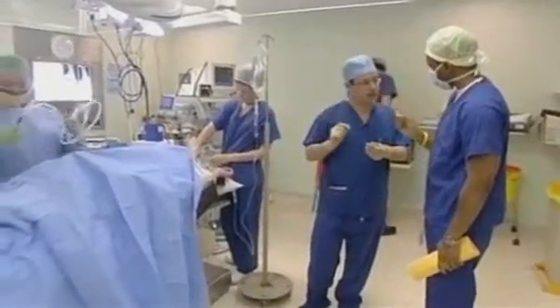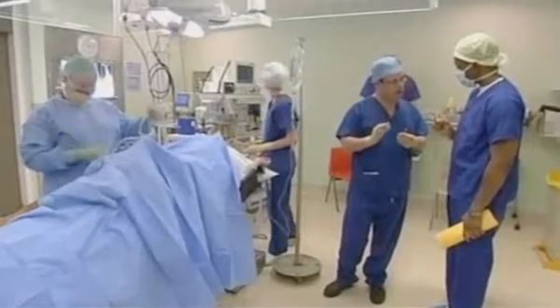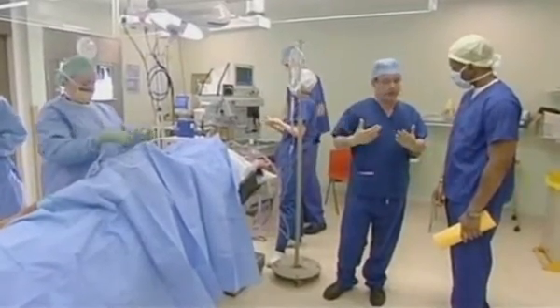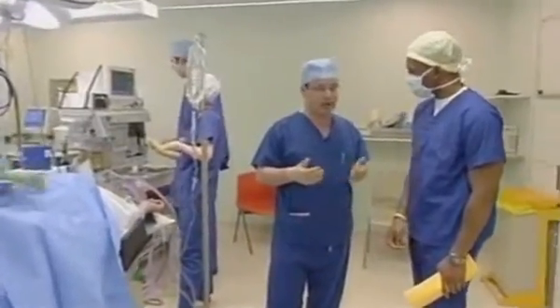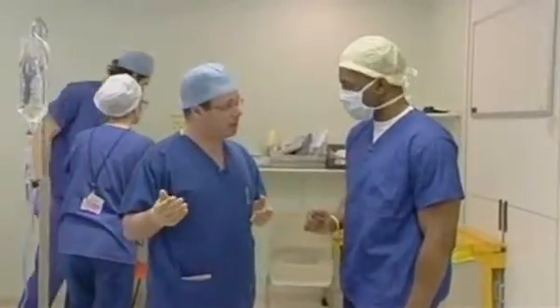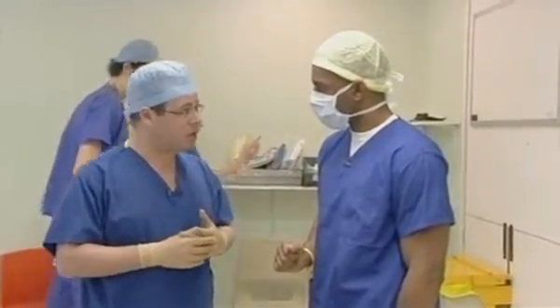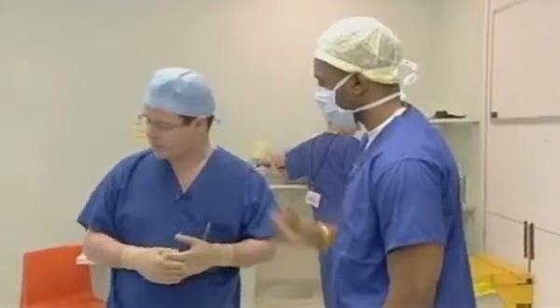And why do you do that in particular? I need to be very precise in the placement of my needle to be very adjacent to the nerve. Then I inject local anaesthetic very close to the nerve. The nerves will then be anaesthetised, and this will give adequate pain relief, which will last anything up to 24 hours, which is very important because this surgery can be quite painful. Right. And so if you are able to provide excellent pain relief for the first 24 hours, it would make a huge change. And it's very beneficial to the patient. Right, well, thank you very much. I'll let you carry on. I know you've got stuff to do.